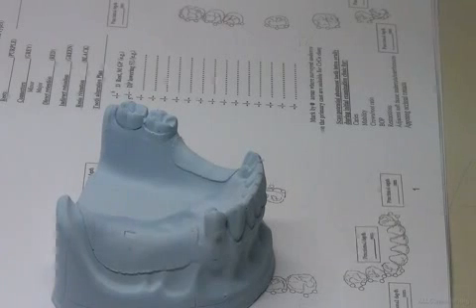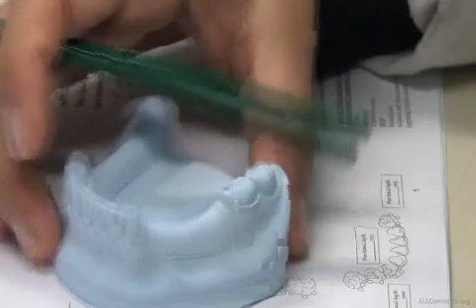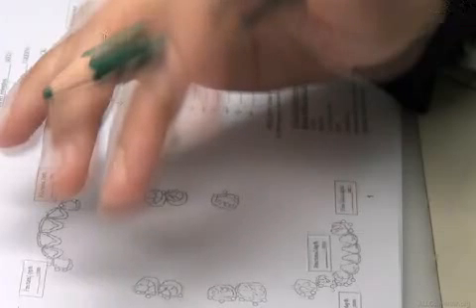But when we have a free end saddle, what do we have? Tooth-tissue support, okay? Now, in the cases we have designed, we have not followed even the simplest design. I'm going to talk first about the simplest design, and then move on to how we change it. Okay? So, we have a bounded saddle. Any bounded saddle. Let's say we have the bounded saddle here, in the lower left area, page 3, on the design paper.